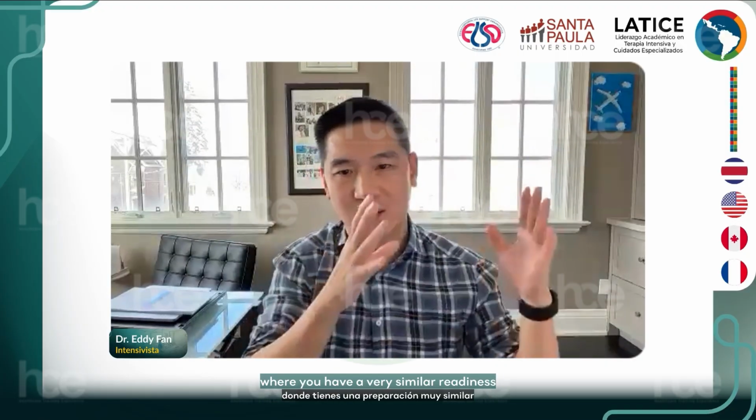And so Ricardo and one of our colleagues from Vanderbilt, Whitney Gannon, are on the verge of completing a randomized trial. I think we have 8 patients left to randomize. We're at 312-ish patients using this approach, where you have a readiness or safety screen to make sure of all the usual things you think about in ARDS. There's been improvement radiologically and clinically, there's reasonable compliance, they're on moderate ventilator settings, and this sort of thing. And then, presuming you pass the safety screen, the patient could have a sweep off trial to see if they can come off ECMO.